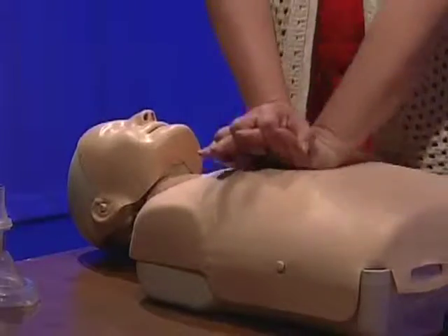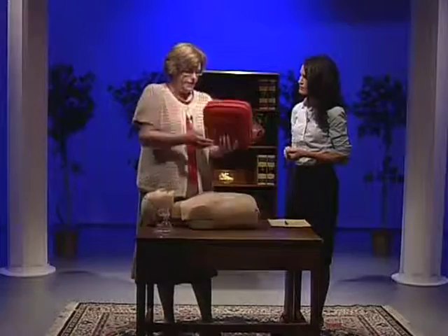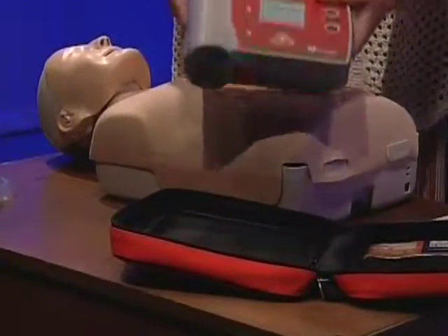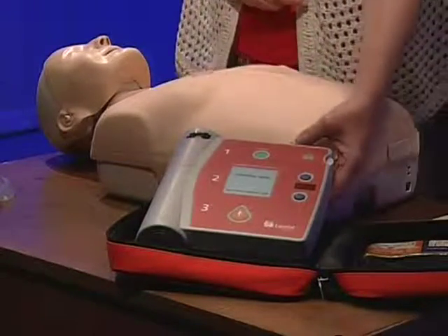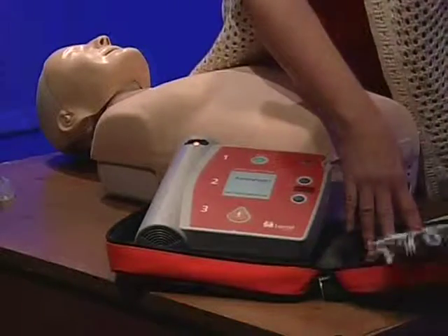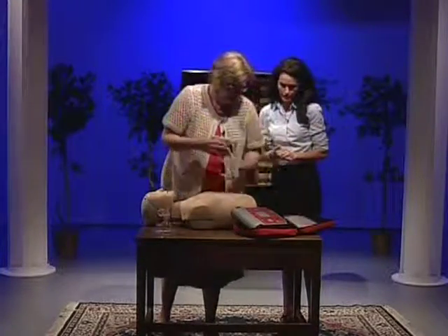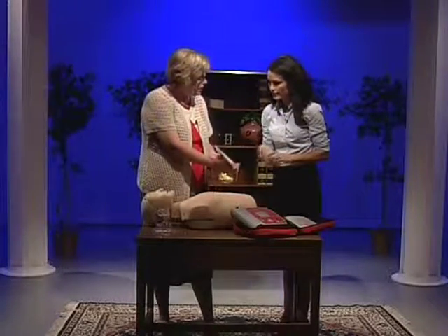Now we're going to pretend that you made it back with the AED. As soon as the AED arrives, I'm going to open that up, I'm going to stop my compressions, and I'm going to turn it on. I'm going to turn it around so they can see. Apply pads to patient's bare chest. It's telling me what to do. Pads connector. And it'll get kind of angry with me if I don't do it quickly. So I've got a set of pads in here, and I'm going to open those up.